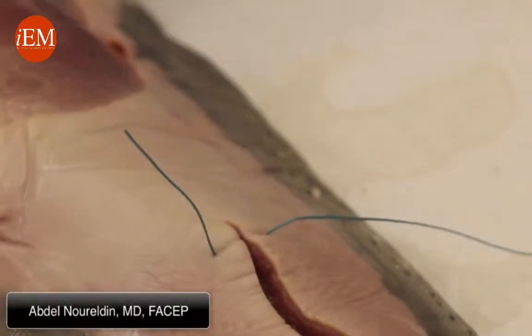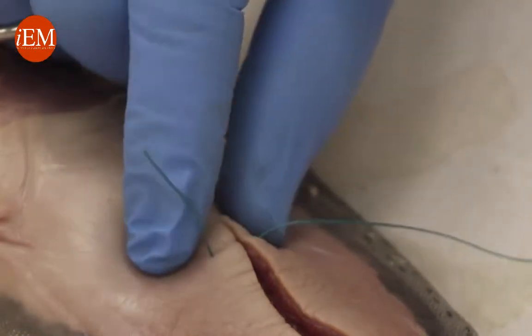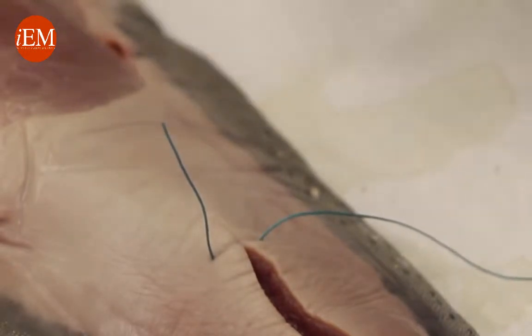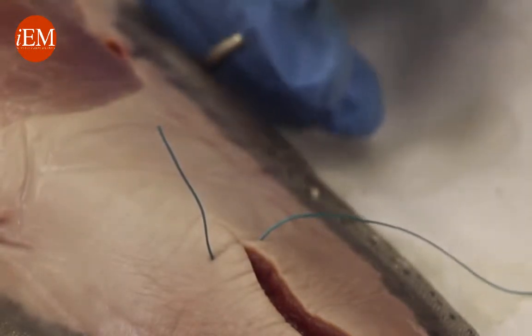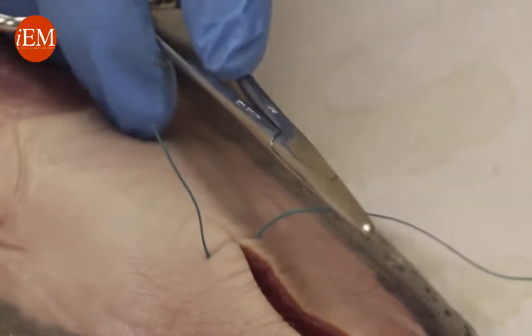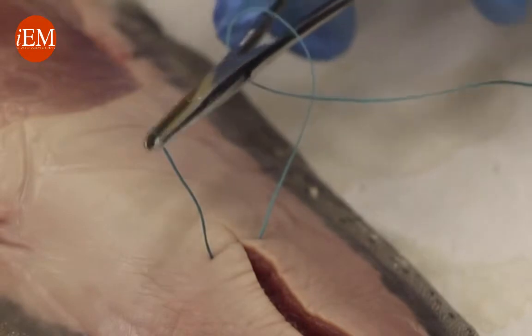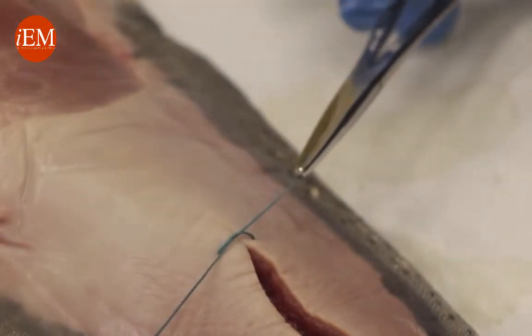A slipknot is used to make sure that there is no tension on the edge of the skin — just the right pressure on the edges. You put the driver in between, wrap only once, not twice, grab the tip, and pull away from you like you normally do.